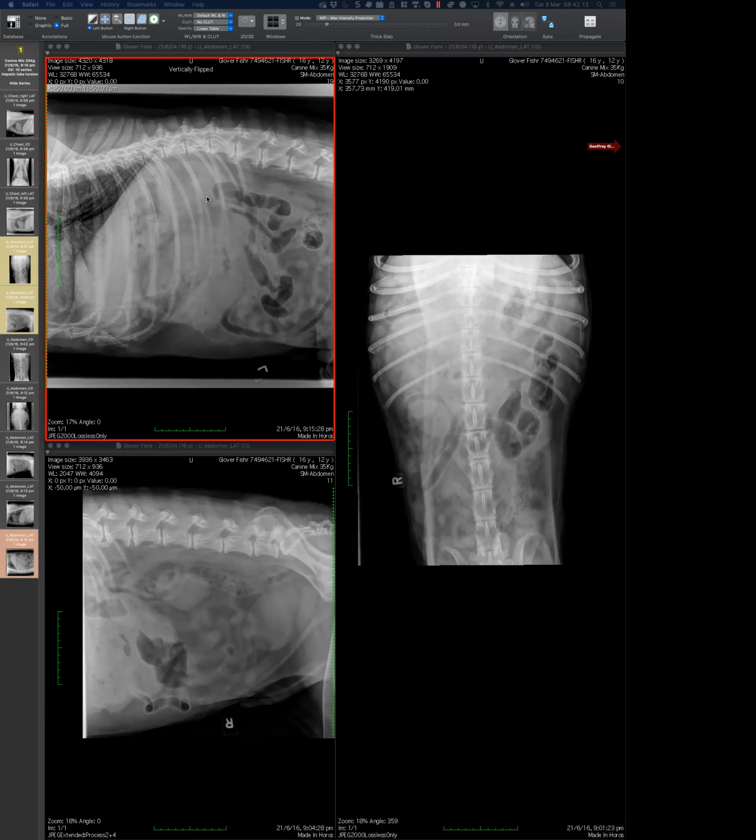Agree. I agree. So I think first line, cheaper, non-invasive, no need for sedation. I would put a probe on and I think you get already a lot of information, things that we were considering. Where is it coming from? You may or may not decide. I don't know. It's not going to be for sure that ultrasound is going to give you that answer, but probably you can at least say, is the spleen okay? What about the liver? Can I see a connection with the stomach? Can I see a connection with the bowel? So I will give it a go like that.